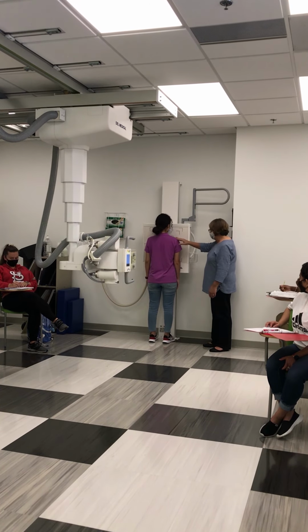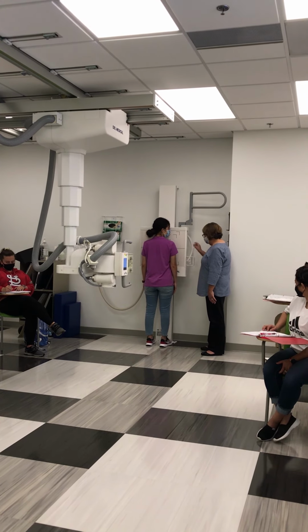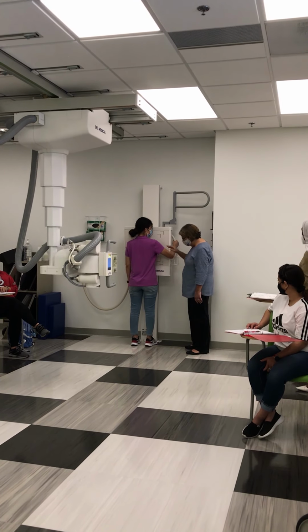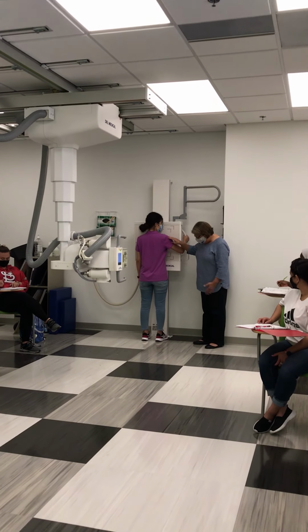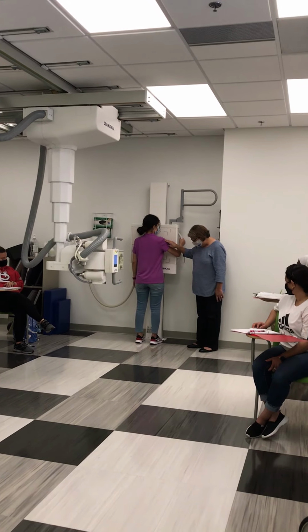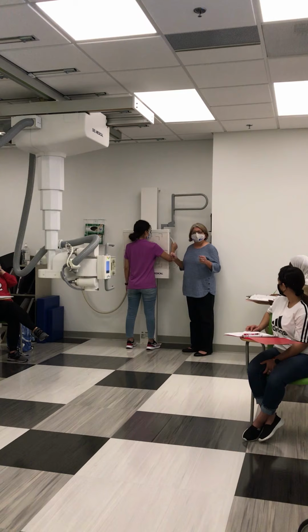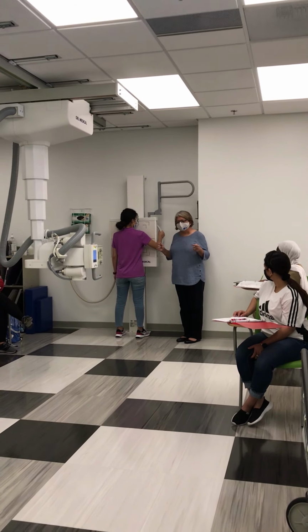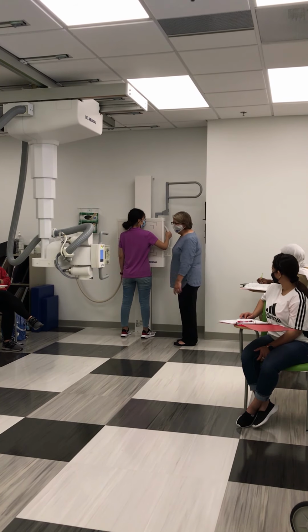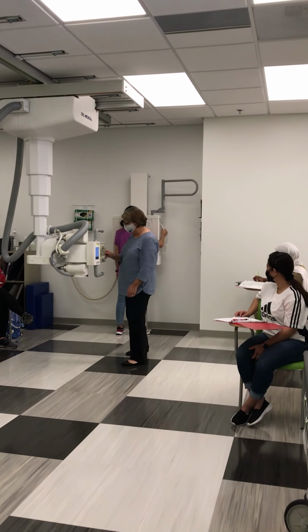Rather than just have your patient lean in, you would say, take a step toward that board. Right. And now I want you to reach forward with your hands and grab the bar that's in front of you. I want you to stand with your feet separated, shoulder width apart, a little bit farther. And that's to provide stability for your patient, because you want to reduce the possibility that they're going to wobble.